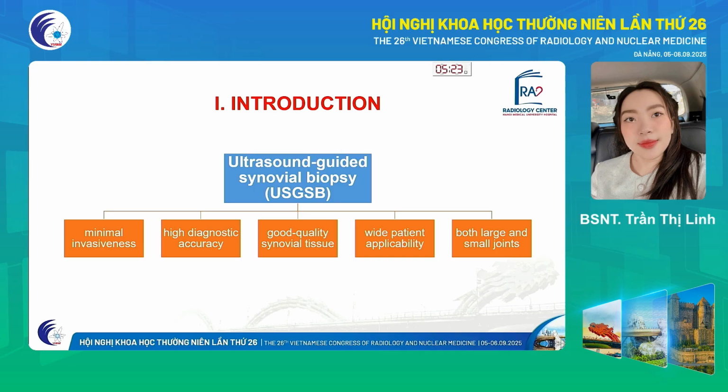for the same joint. Plain needle and fluoroscopic guided biopsy are more difficult to conduct in small joints and joints without active synovitis and have a lower success rate for obtaining synovial sample than other methods. Cost and technical simplicity favor plain needle biopsy, while suitability for serial biopsy and biopsy in small joint favor USGSB. Compared with arthroscopy biopsy, USGSB is less invasive and can be conducted in both large and small joints.